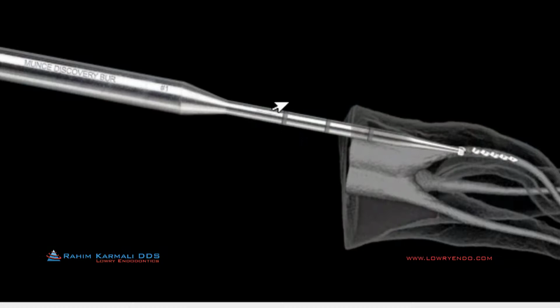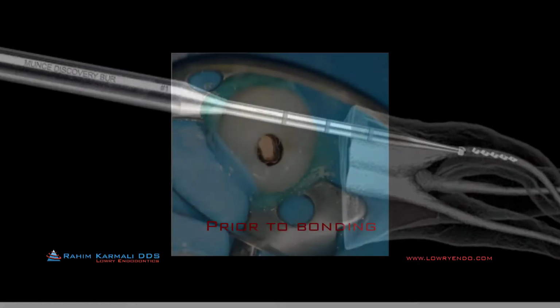This is what the Munce Discovery burr looks like. It's a very long shank that's very tiny at the tip, and it comes in different sizes, all the way from a 1/4 round on up. This was a number 1 round, and we can use that with great visibility under the scope to shave away a little bit of that dentin so we can expose that third split.